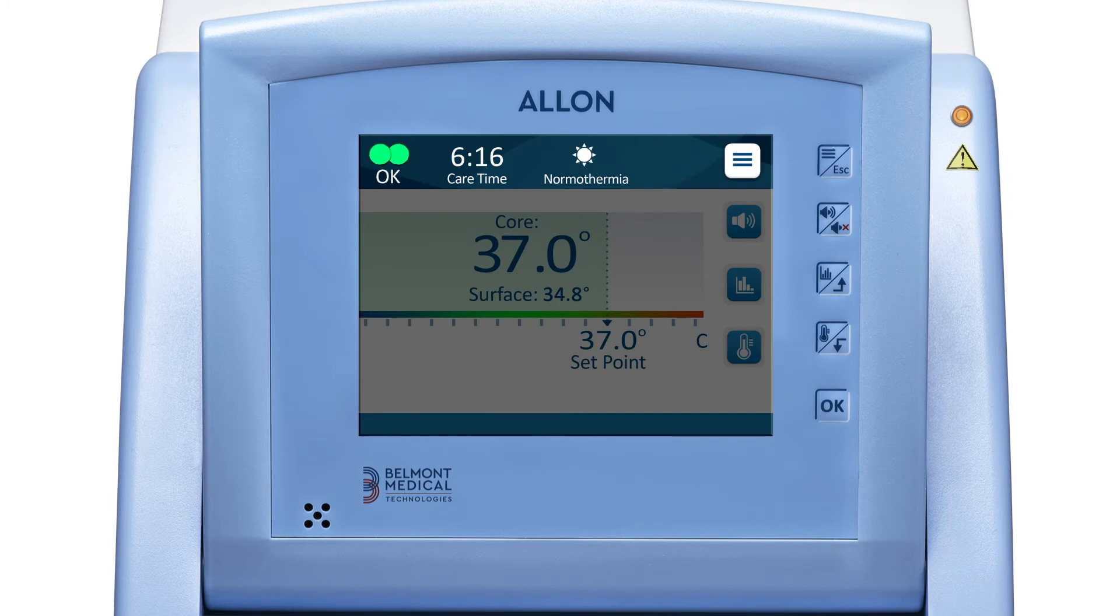At the top are the circulation icon, which shows that water is flowing through the wrap, as well as the duration of treatment, the mode of operation, and the main menu icon. Icons for the temperature graph and the set point selection appear on the right.